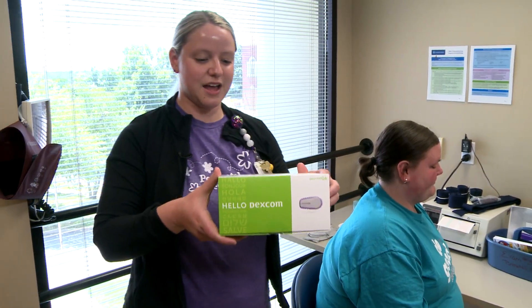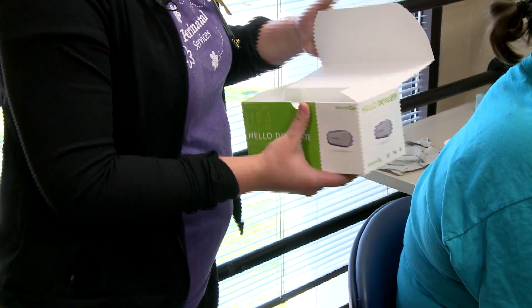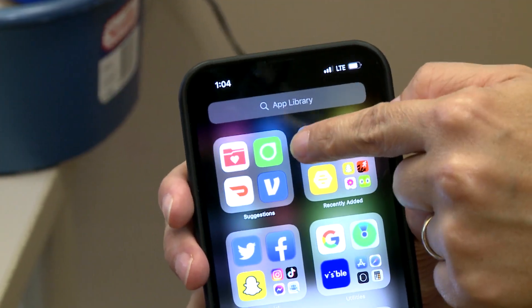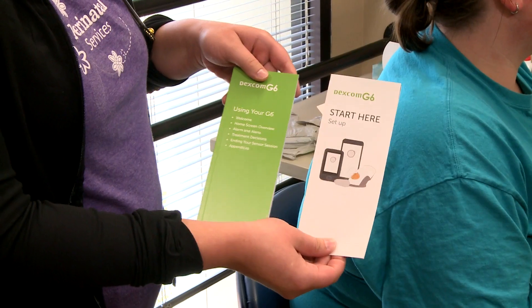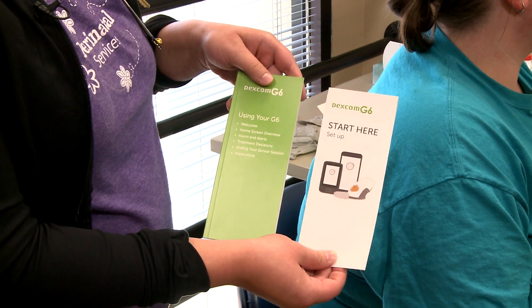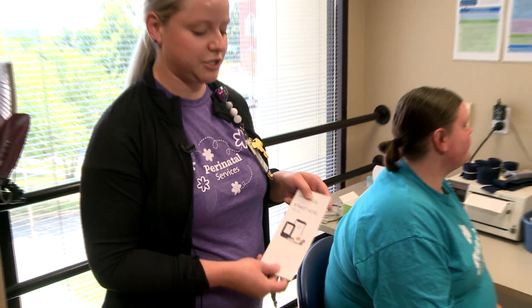When you get your Dexcom supplies, it's going to come in a box like this. First thing you're going to want to do is get the app on your phone. Your box will come with these two information packets, and this will tell you how to set it up on your app. If your phone is not compatible, which we run into sometimes, we can get you a receiver, and you can check the Dexcom website to see if your phone is compatible.